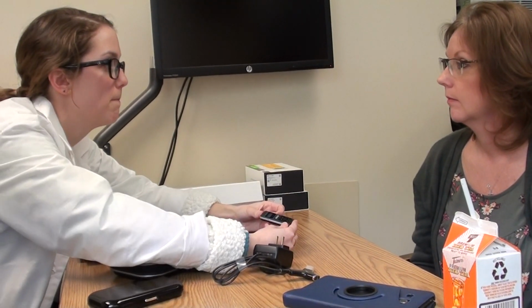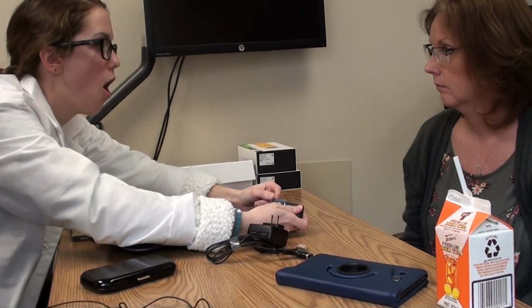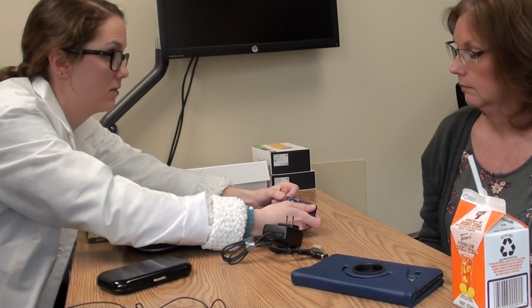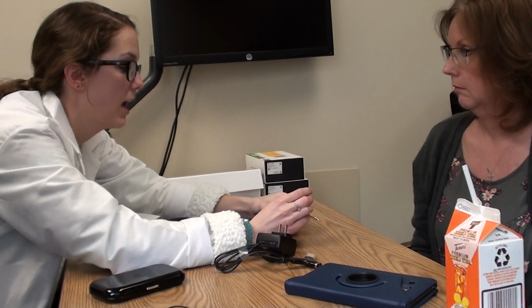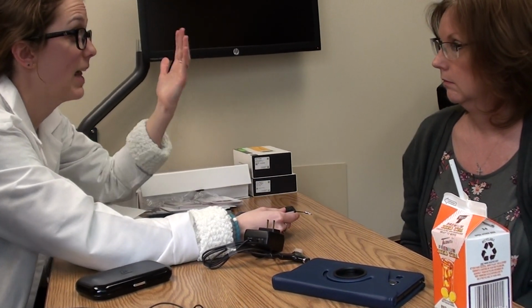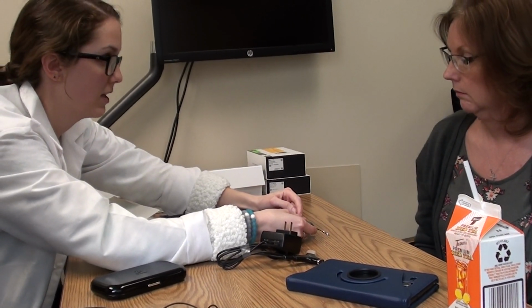Okay, this is your remote. So this is the on-off switch. When it's off, it'll be red. When it's on, it's green. See, it's green. That's on. These are how to change your programs. And this is the volume. So if it's loud, you'll turn it down with the minus sign, or if you want it louder, you'll turn it up with the plus sign.